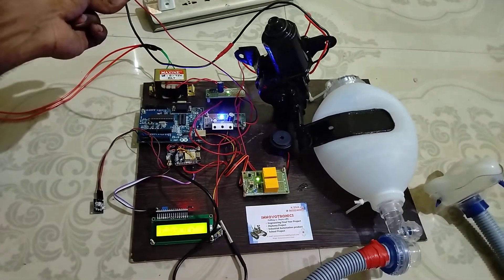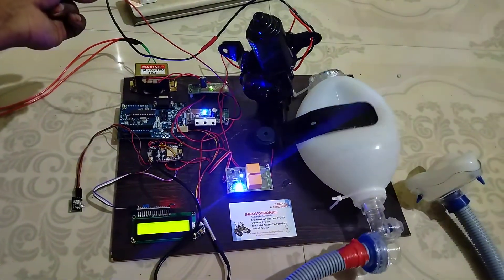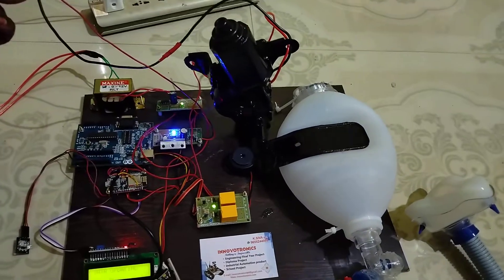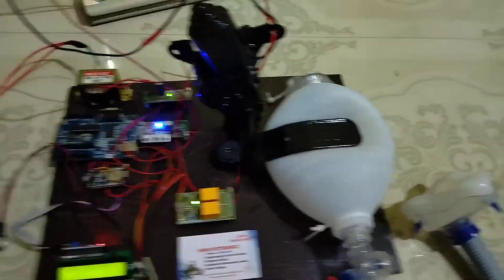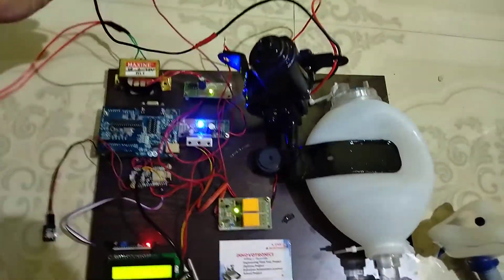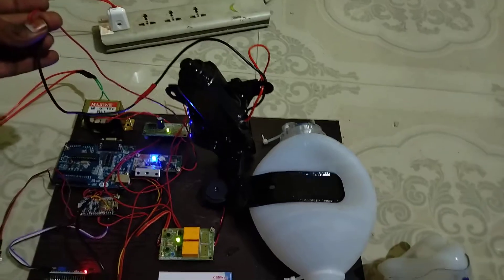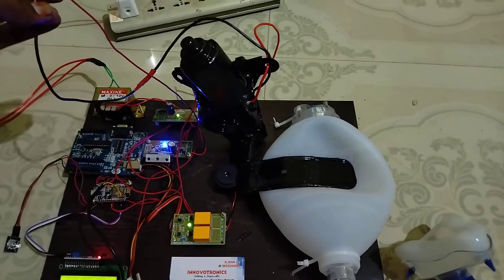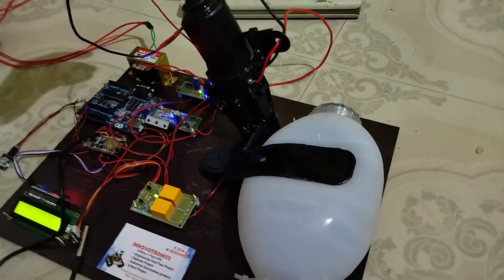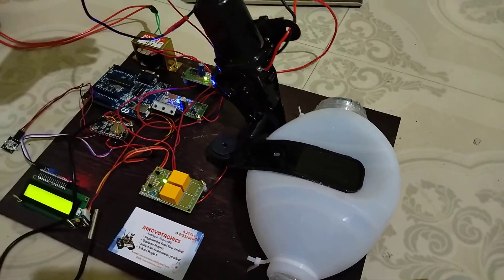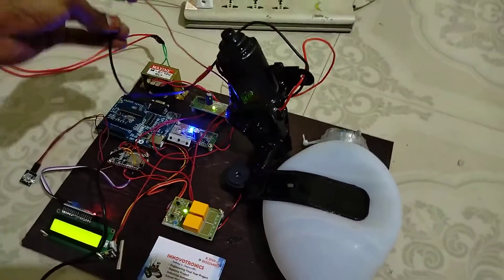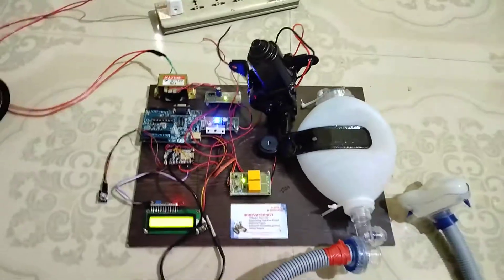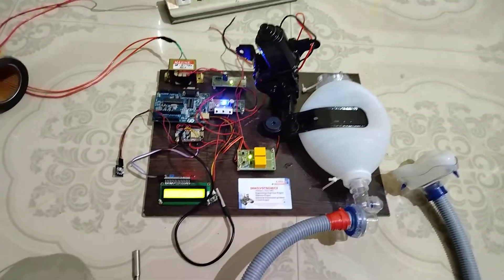The system will automatically recognize and then turn on the mechanism. You can see that. This is the complete unit. For more details, you can contact our office number. Thank you.